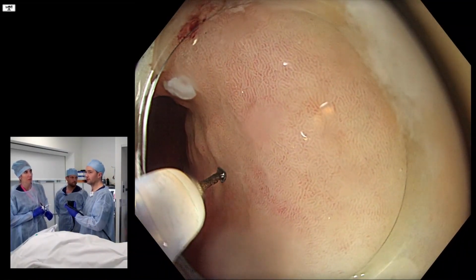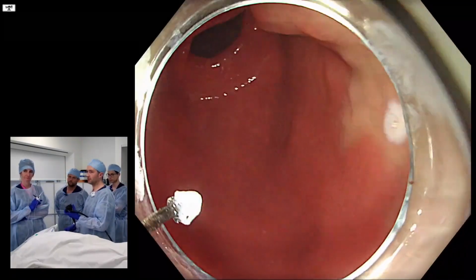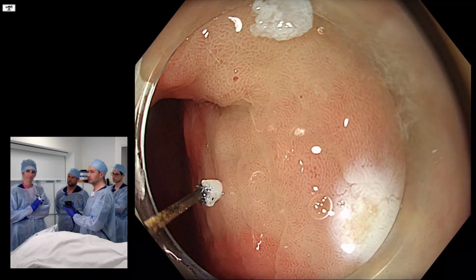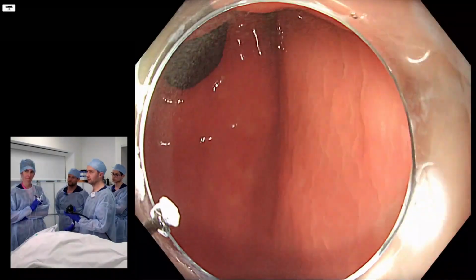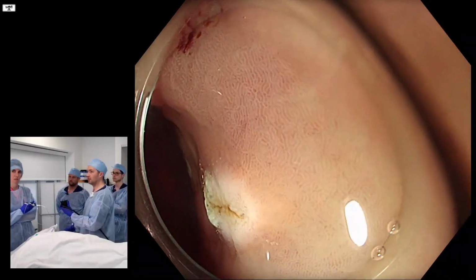Oh, sorry. Soft. Because it would be very easy not to take a margin now, because we just say, oh yeah, we'll just cut that off. And then end up with no margin at all. You know what I mean? Absolutely. So we need to make an incision.